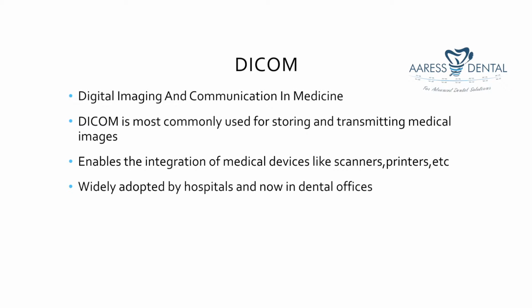DICOM is digital imaging and communication in medicine. DICOM is most commonly used for storing and transmitting medical images. This is the format in which we get the CBCT from the CBCT centers. It helps us to integrate medical devices like scanners, printers, etc. It is also now widely adopted in hospitals and dental offices.